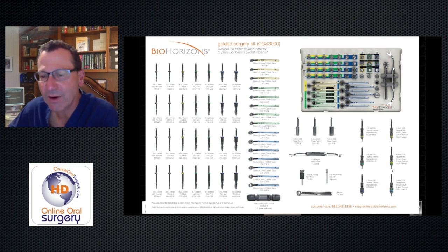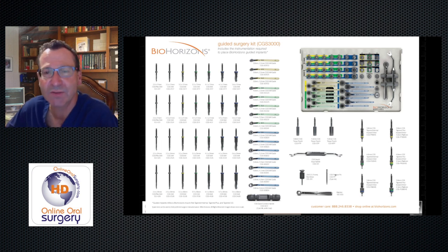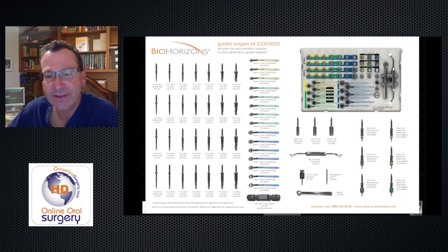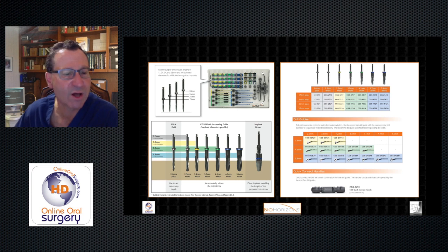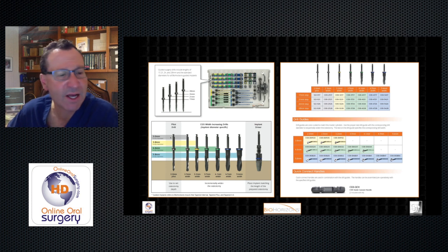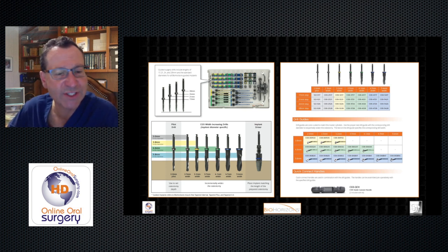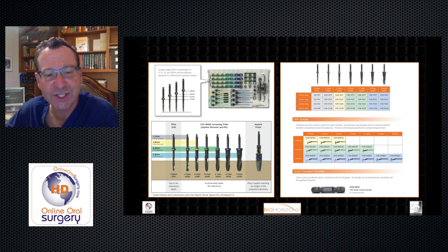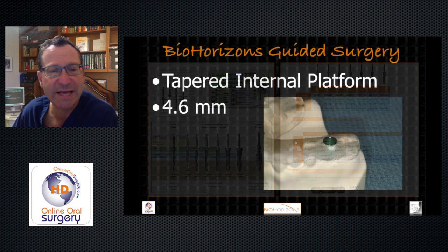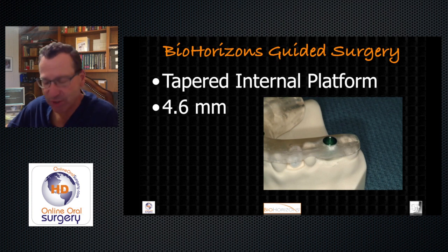The complete surgical kit includes all the drills, drill guides, and a quick-connect handle — two of these in the kit — where assistants place the drill guides into both ends, giving good control over the drill guides while reducing the number of components. We also have tissue punches designed to go through the surgical guide drill sleeves, implant drivers, a typical ratchet hand wrench, and for fully edentulous cases or large edentulous spaces, three fixation pins are included. There's also a depth stop handle I'll show you how to use.